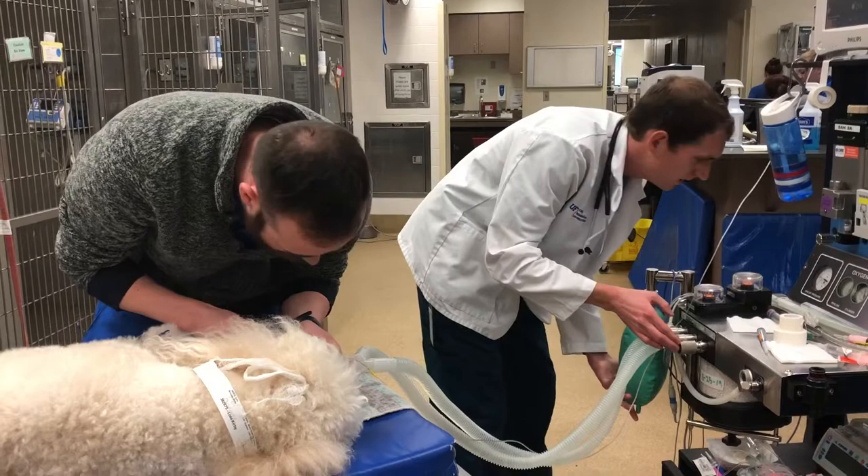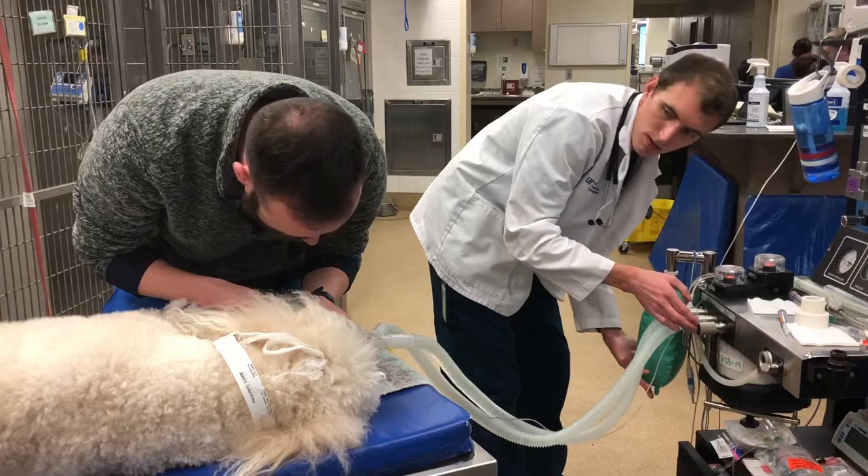My name is Chris Carrasco. I'm going to be demonstrating how to properly utilize some anesthetic monitoring equipment.